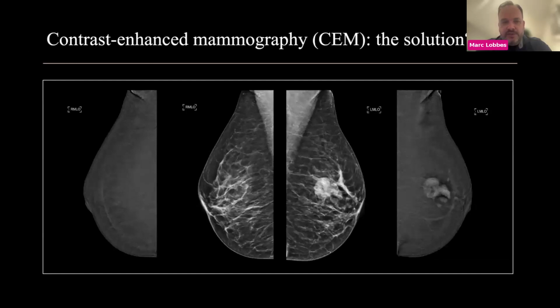Now, areas of contrast captation are suspicious of breast cancer, but are not really a proof of breast cancer. Some benign structures like fibroadenomas can also show some enhancement at certain times, and there can be a reason for false positive even in contrast-enhanced mammography examinations.